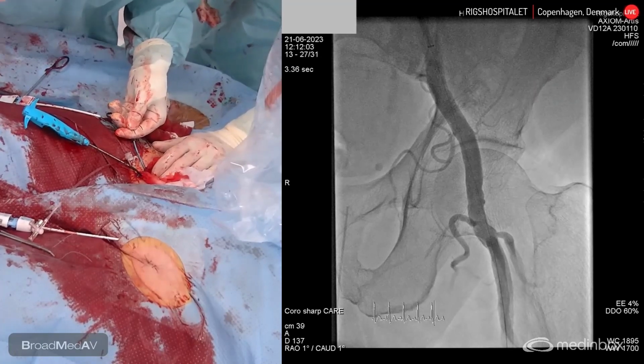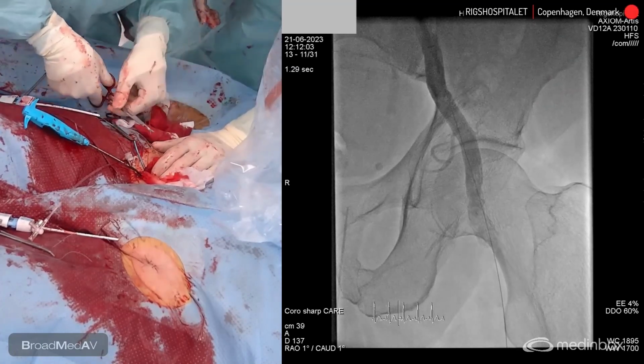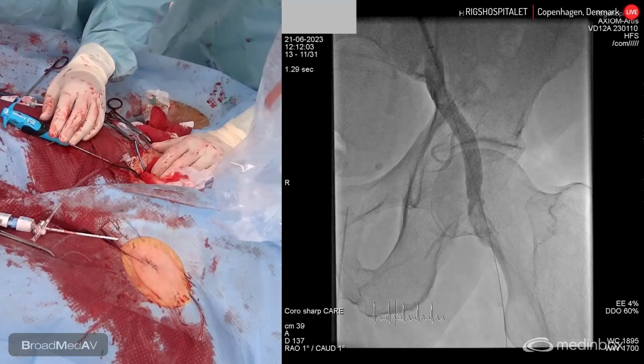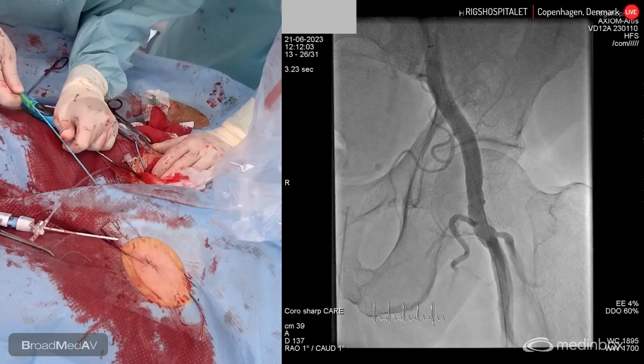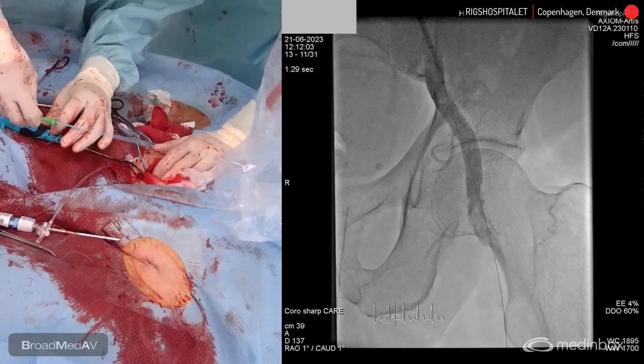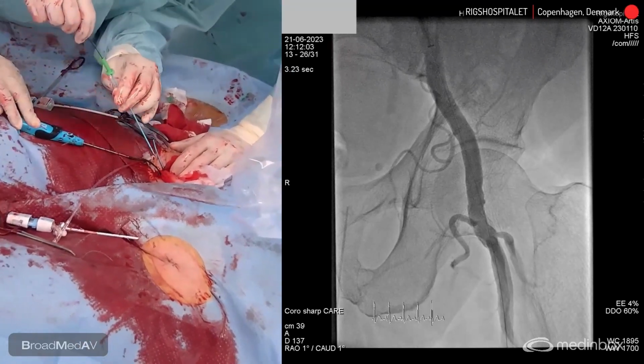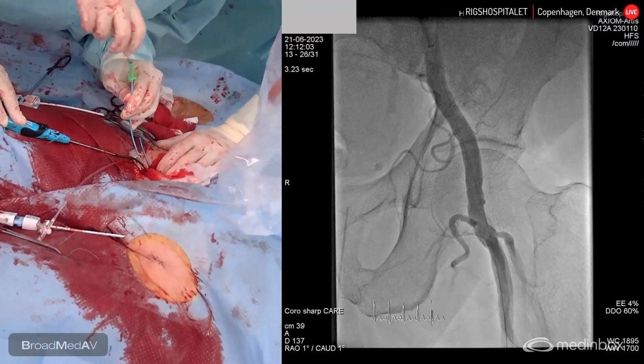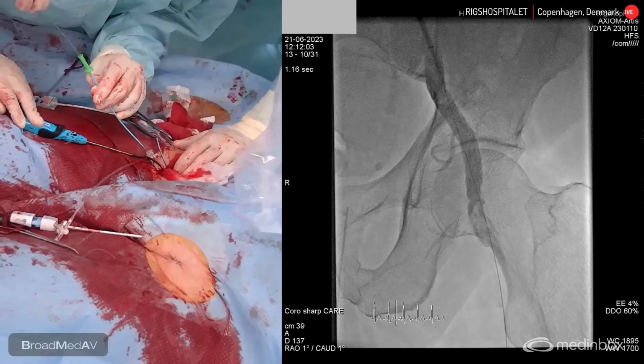Yeah, good question. Indeed, that's what I was doing. So I was overlapping first the posts in the cusp overlap more, and then I was overlapping in the right non-cusp overlap. That's the extreme left anterior oblique cranial, and that actually worked better here.